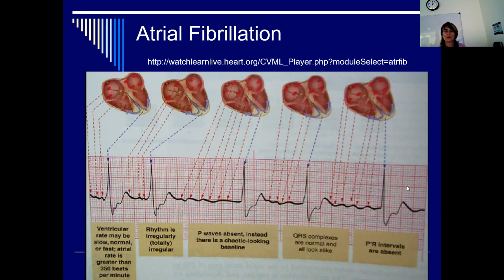So it's a very irregular rhythm, and that's what'll clue you to a possible atrial fibrillation, irregular rhythm. Then the next thing you know is you don't see a nice P wave before each QRS. Here you might say, oh, that looks like a P wave, but you don't always see it. Like here there isn't one. And that's because the atria are not depolarizing normally, and it's causing them to quiver or fibrillate. All right, now let me go back to the list.